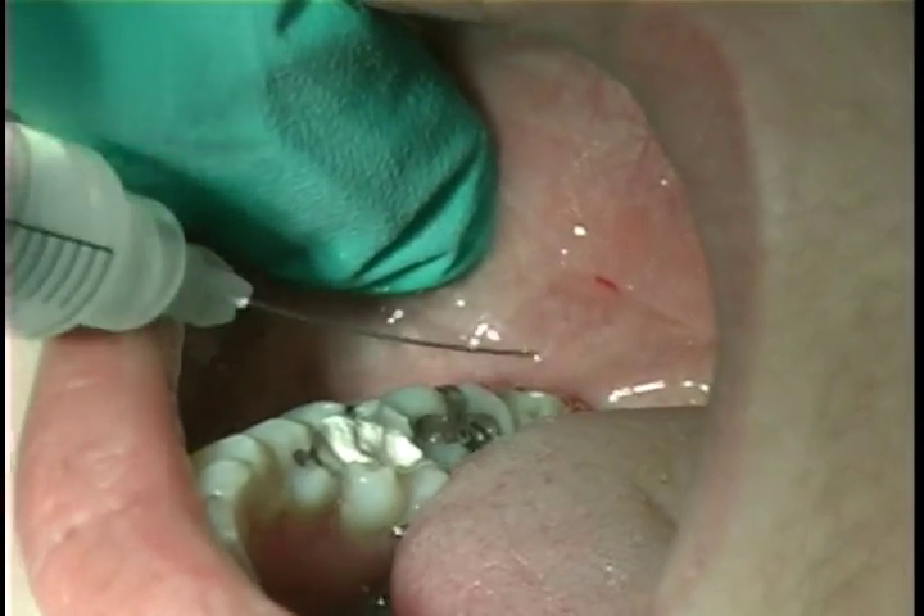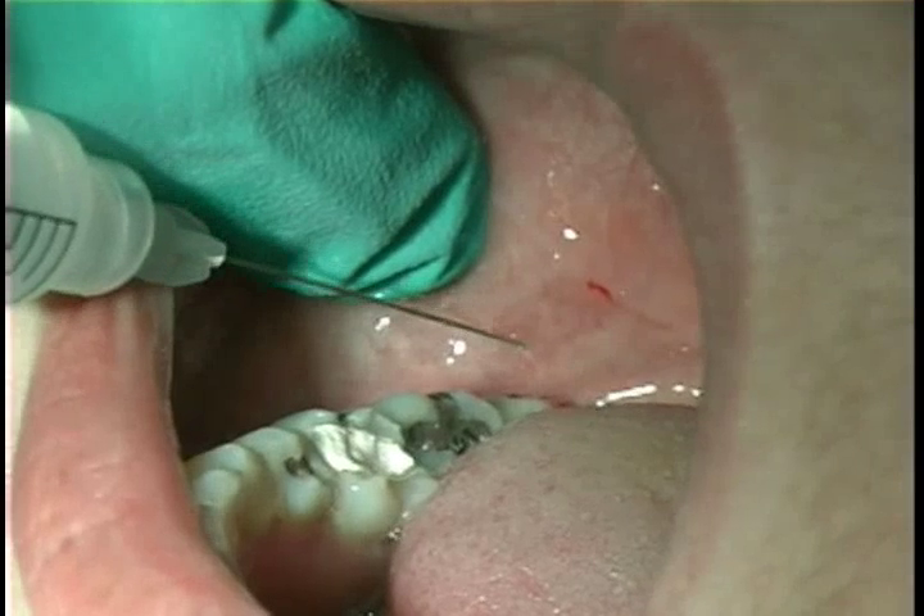After the IA nerve block, an injection is given at the long buccal nerve.